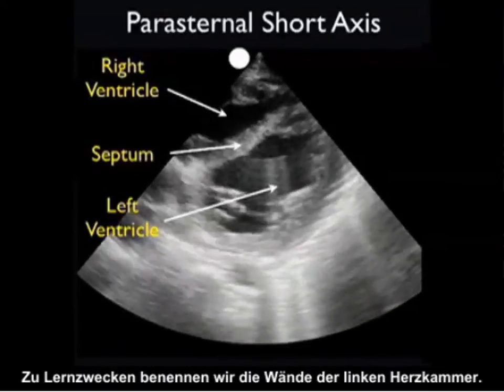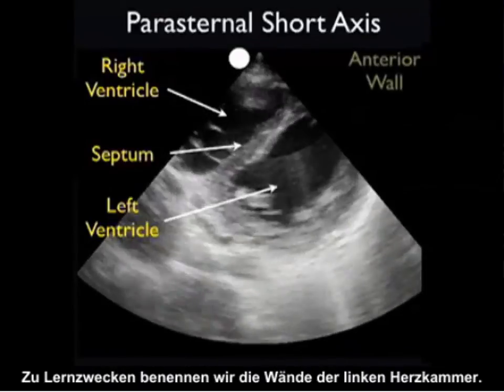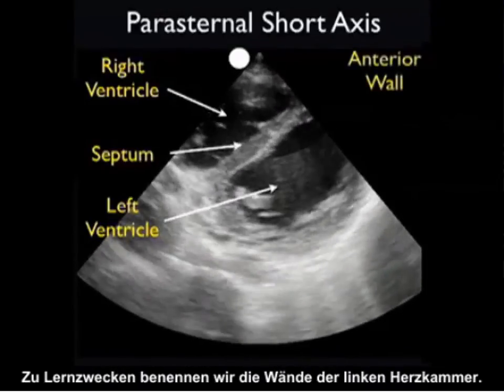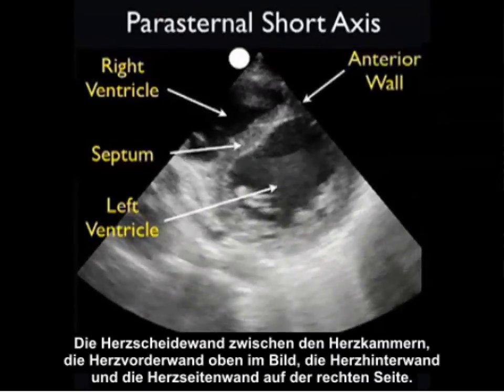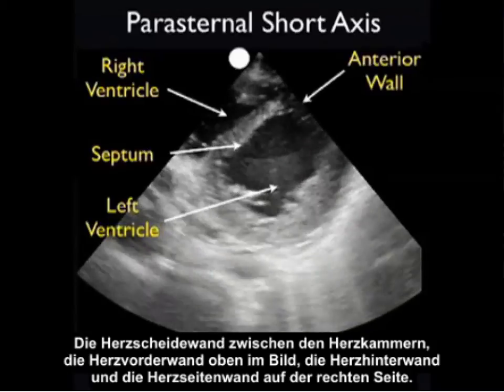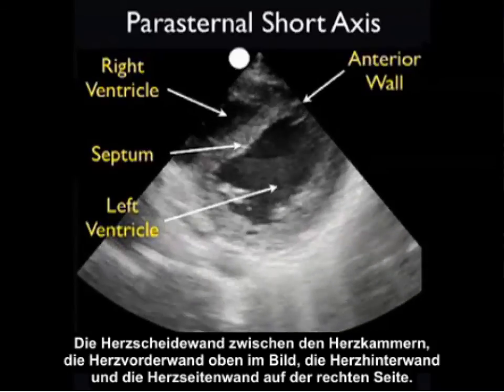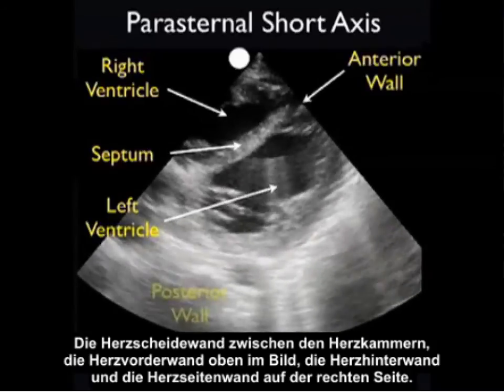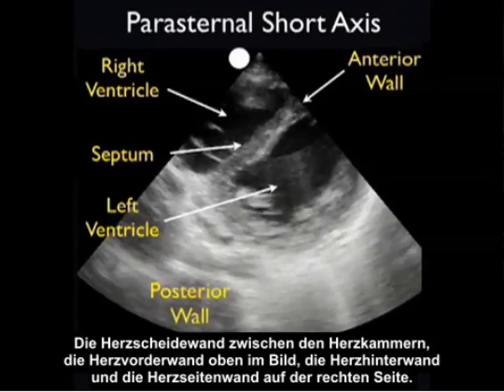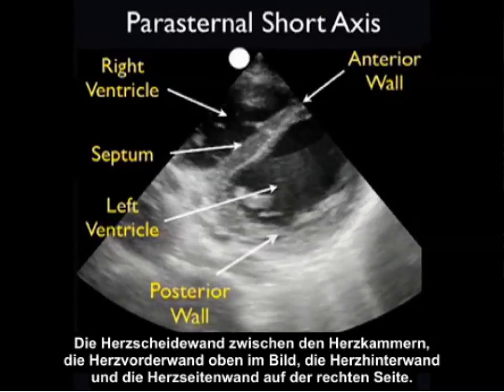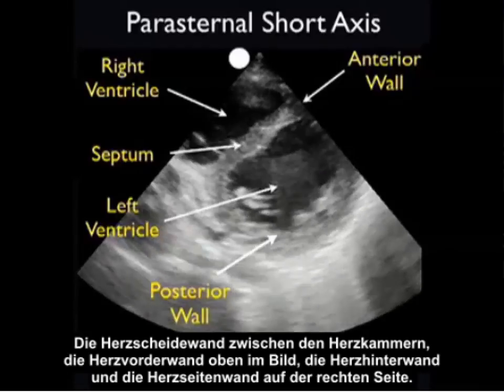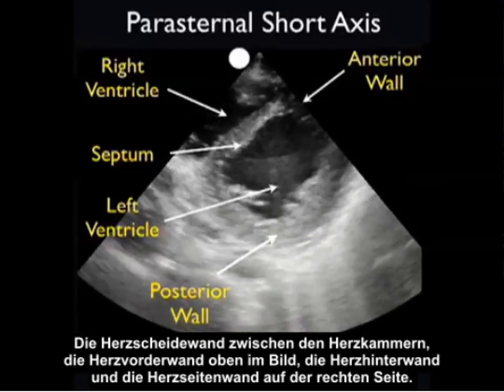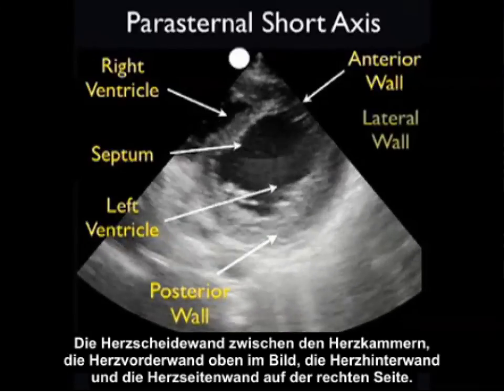For learning purposes we'll identify the walls of the LV: the septum in between the ventricles, the anterior wall to the top of the screen, the posterior wall to the back, and the lateral wall as shown towards the right portion of the screen.